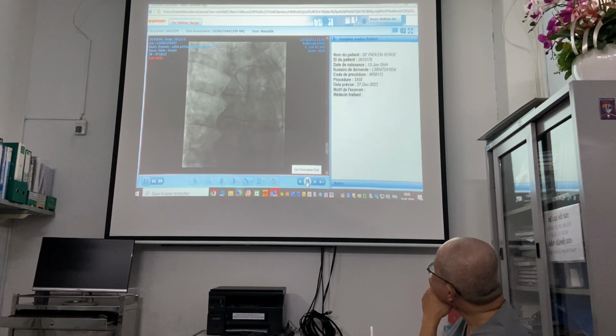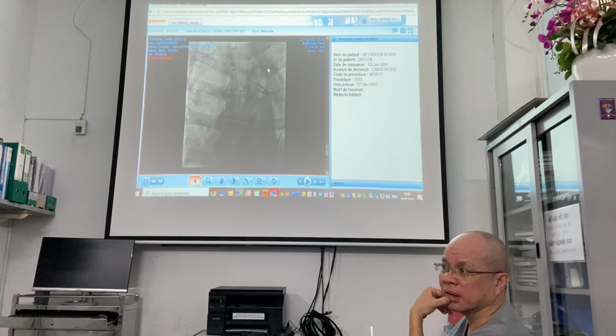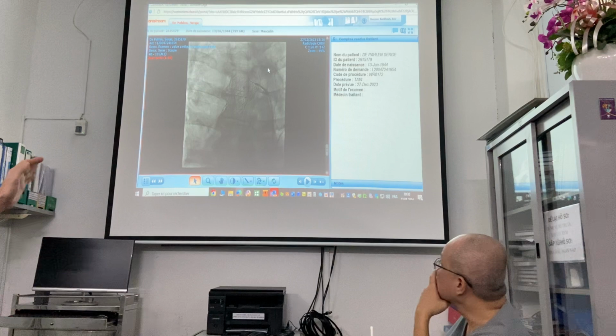You will see that I can just snare it. And now I have the valve here, okay? So now the point is what to do. You see this is calcium here. I think this is my first embolization of CoreValve. I never had one. But my colleagues had 2, and 2 times the fatal outcome. The patient had aortic dissection and passed away. So I was very scared to have aortic dissection.